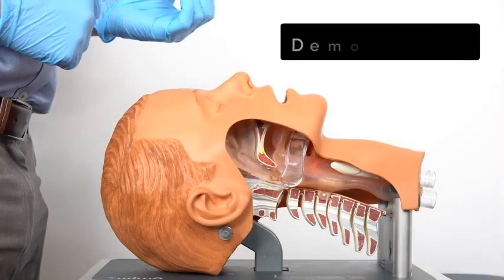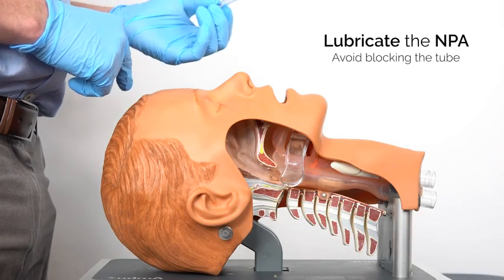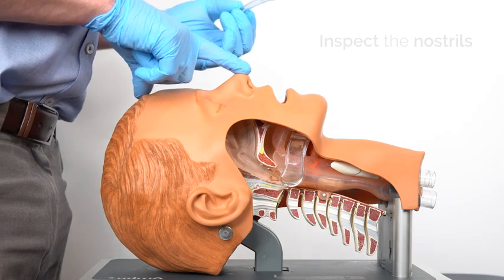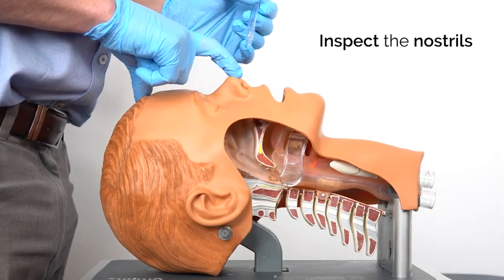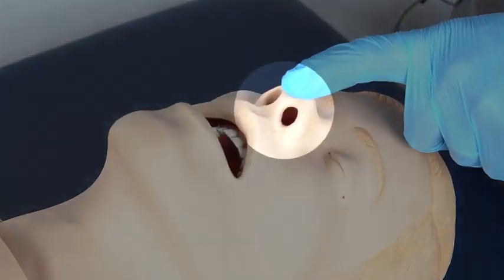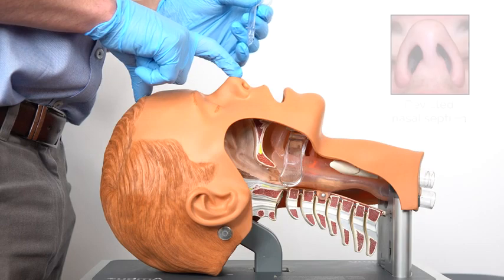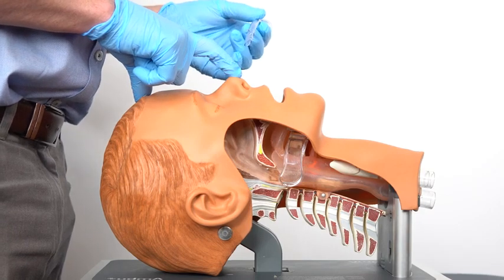Standing in this position, I'm in a good position to be able to see everything that I need to see. I've got some lubricant on the outside to help, and then with my non-dominant hand I'm just going to pull the nose slightly back so I can see which nostril is largest. In general, we go for the right nostril first, but it's important you have a look to make sure there's no deviated septum or large inferior turbinates that may hamper you putting this in.